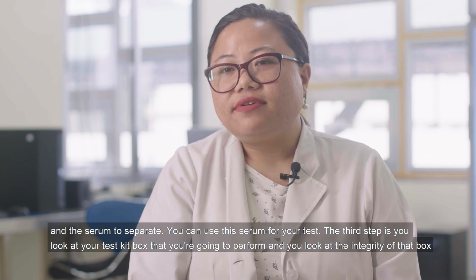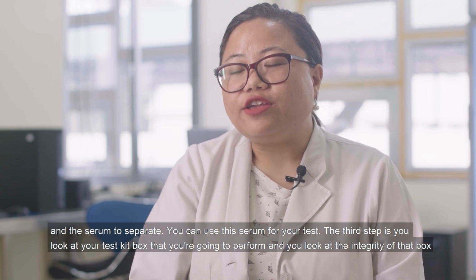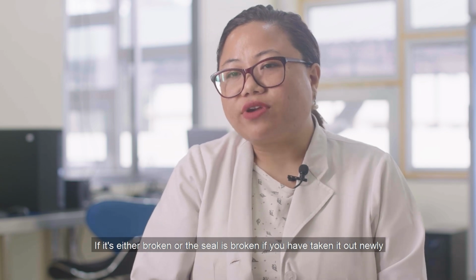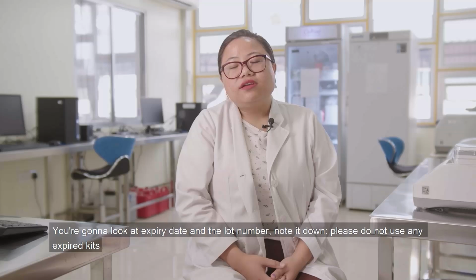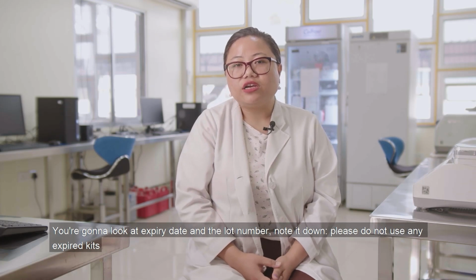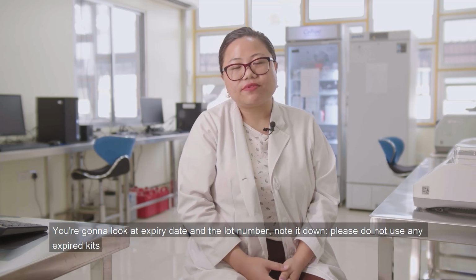The third step is you look at your test kit box that you're going to perform, and you look at the integrity of that box, whether it's broken or the seal is broken if you have taken it out newly. You're going to look at the expiry date and the lot number. Note it down. Please do not use any expired kits.